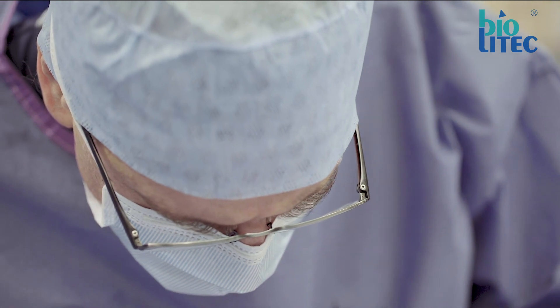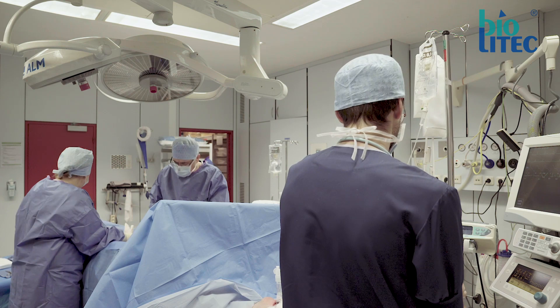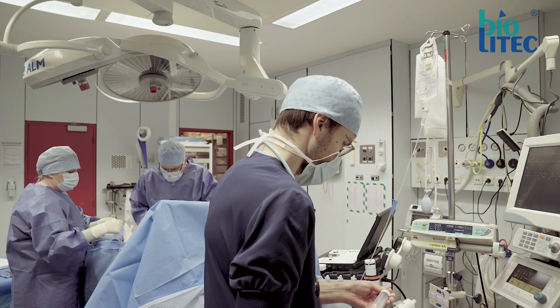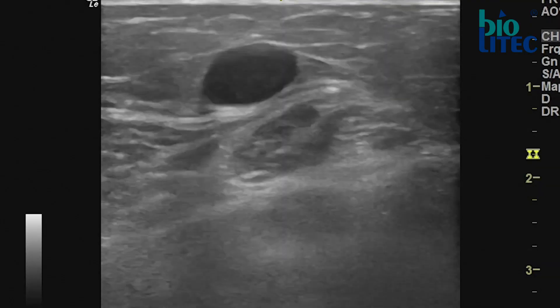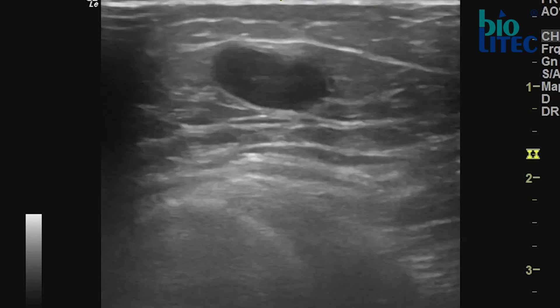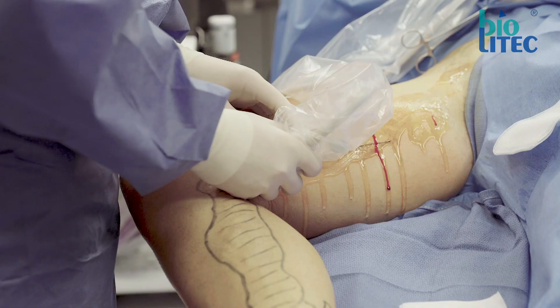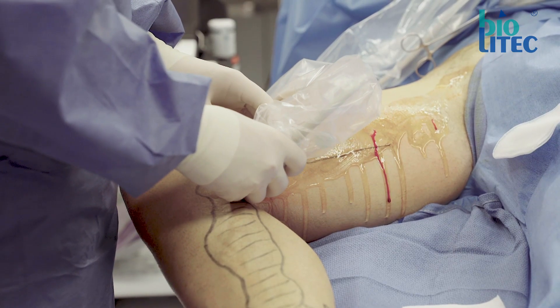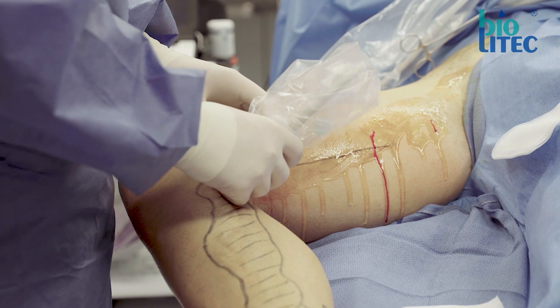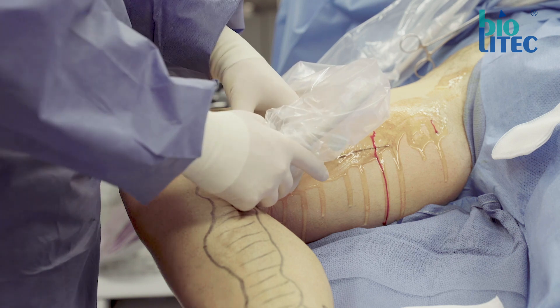When it comes to getting access to the vein there are four important steps: first choose a target, second aim, three strike, and four hit. The purpose is to treat the truncal varicose vein up to the point where the insufficiency ends. I always try to start a little lower, so in case of a failed puncture I can still move a little bit up. Using a superficial side branch to get entry to the saphenous vein can also be helpful.